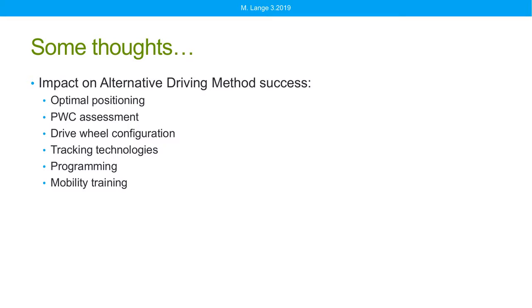We need to do a thorough power wheelchair assessment, including determining whether the client is ready to drive a power wheelchair. Look at the drive wheel configuration, whether it's front, mid, or rear wheel drive, and determining if that's the best option for a client.